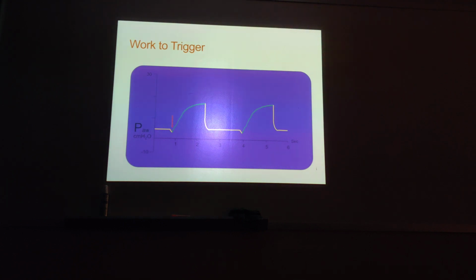So now, anytime you look at the pressure time curve and you see that negative deflection like that, that means that the patient triggered the breath. If it's a machine breath that the patient did not trigger, you won't see that. But sometimes patients can trigger both machine breaths and spontaneous breaths. If you are on a spontaneous mode like pressure support, when the patient is triggering all the breaths, you're going to see that negative deflection before the pressure goes up.